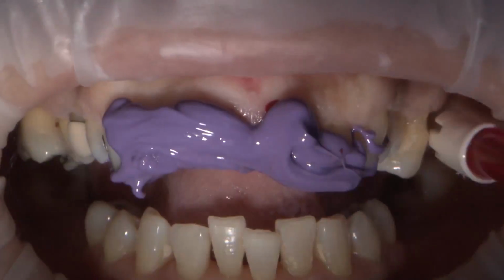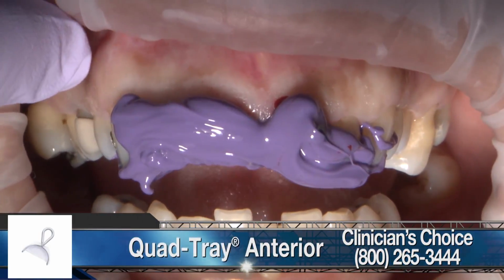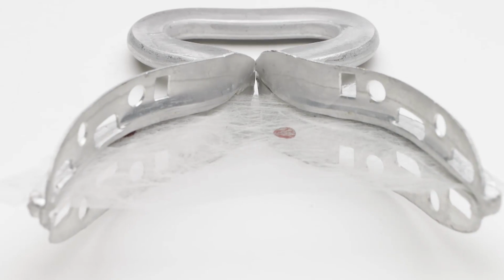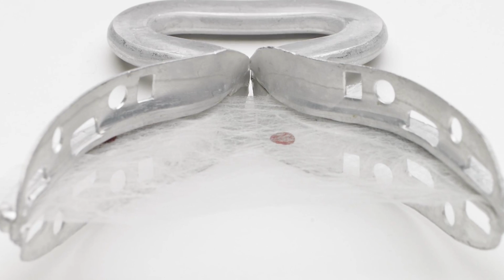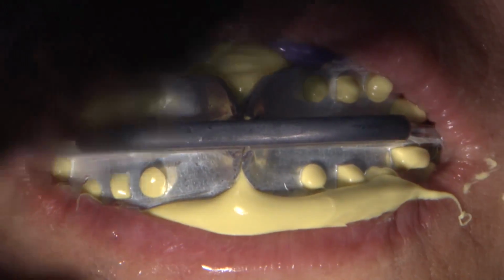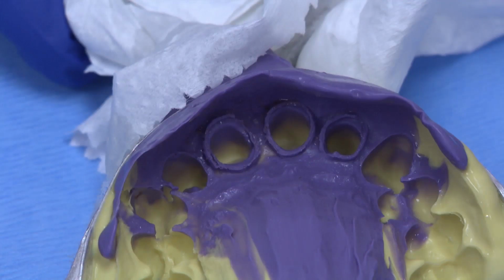We use here a triple tray from Clinician Choice. My criteria for using this tray is for times when I want to impress no more than 1 to 3 units per quad, such as in this case. I like it because it is rigid and it has a thin web, not plastic mesh like other trays, and it locks in the occlusal registration without interfering with the patient closing comfortably.